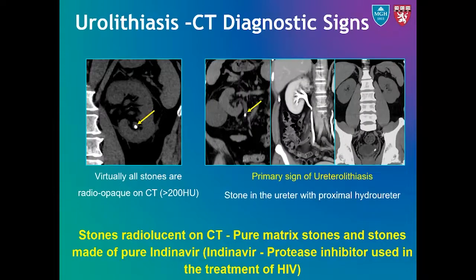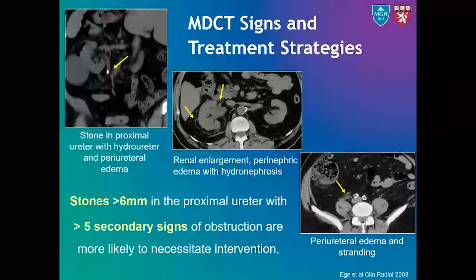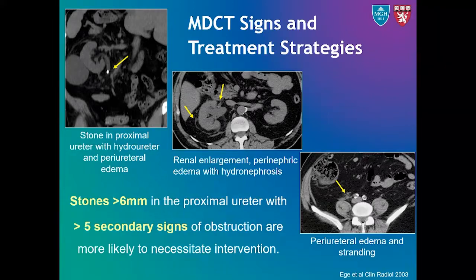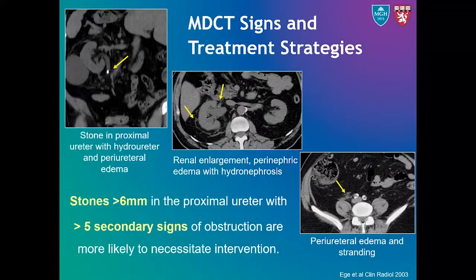Coming to ureteral stones, in addition to direct visualization of hyperdense stones, their identification in the ureter is often facilitated by secondary features such as upstream hydro-ureter or hydronephrosis. The most reliable secondary signs of obstruction include hydro-ureter, hydronephrosis, perinephric stranding, periureteral edema, and unilateral renal enlargement. It is important to remember that the absence of hydronephrosis or hydro-ureter does not indicate absence of obstruction. When five or more secondary signs of obstruction are present in proximal ureteral stones greater than 6 mm, it usually indicates that the patient likely needs some sort of intervention for removal of stones.